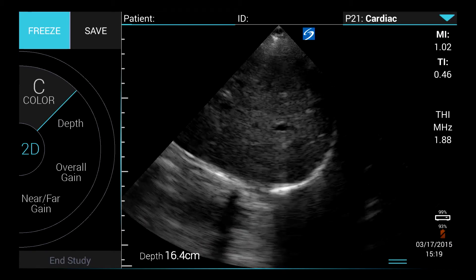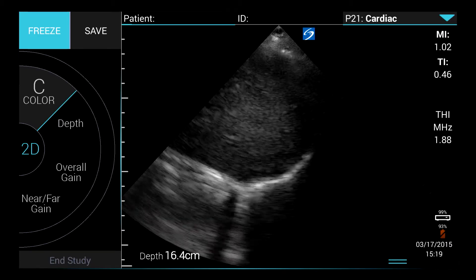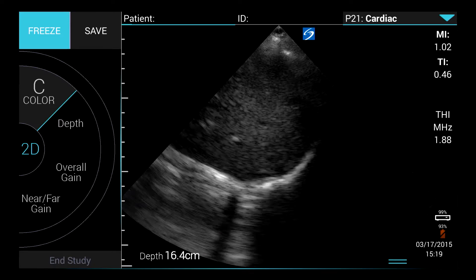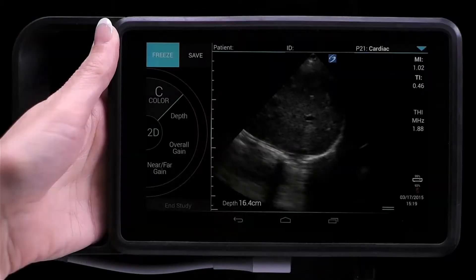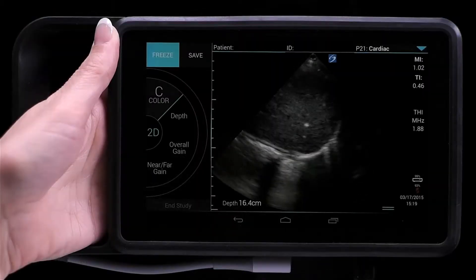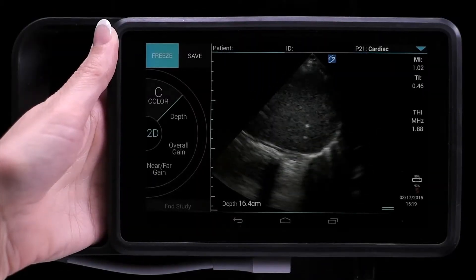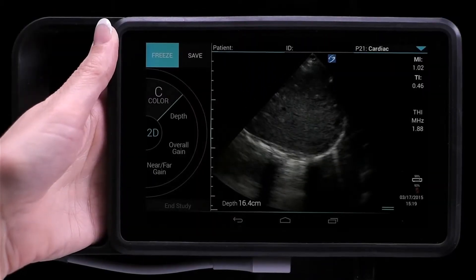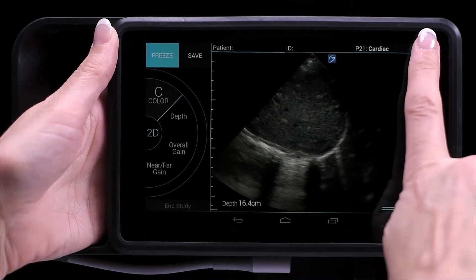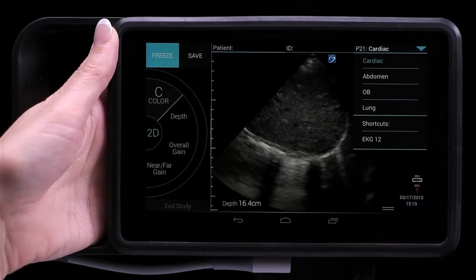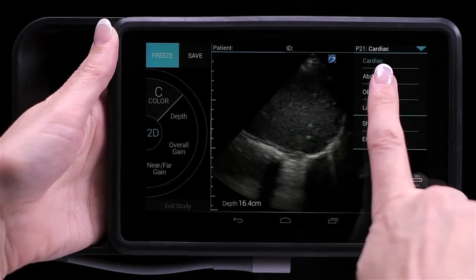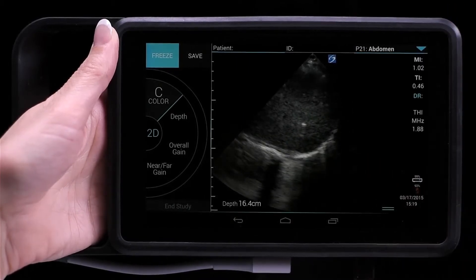To change the scan mode using iViz, to select an exam type while you're scanning, tap the Exam Type drop-down menu and select a different exam type.